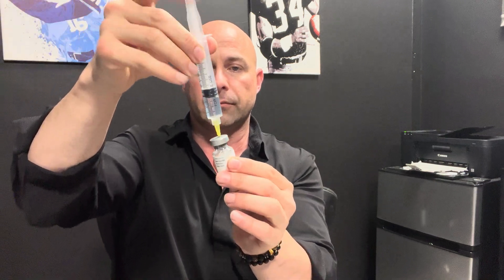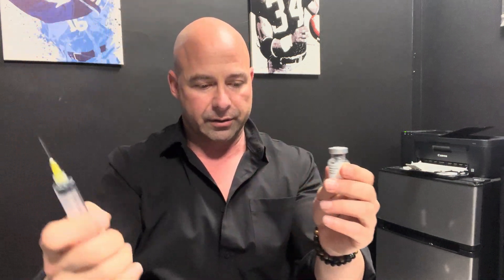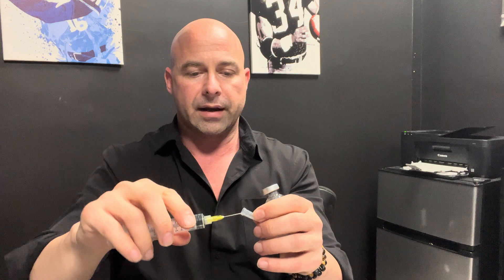Then we're going to get our Sermorelin and put the needle into the cork — look, it just sucks it right in like magic. Recap that. It's going to be a little foamy, so just go ahead and swirl it around. If you shake it a lot it'll just get air bubbles in it, but the water literally dissolves it into clear fluid.